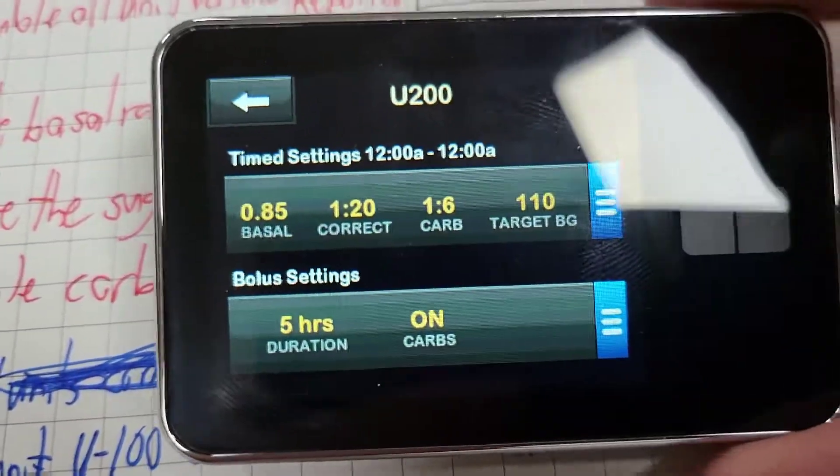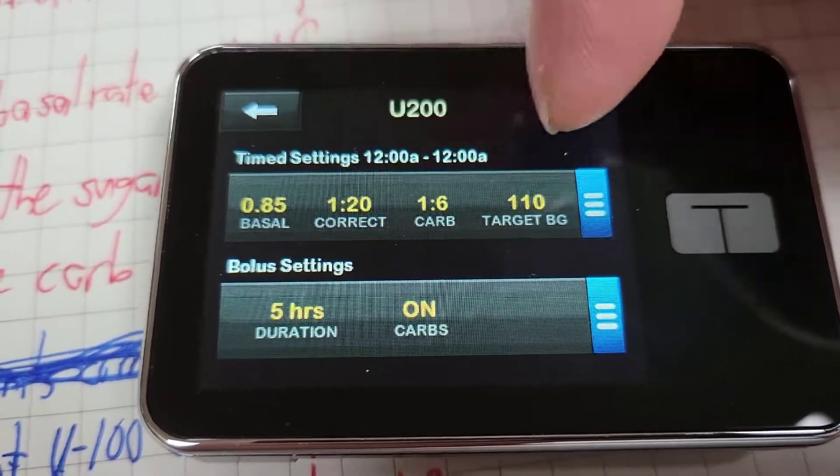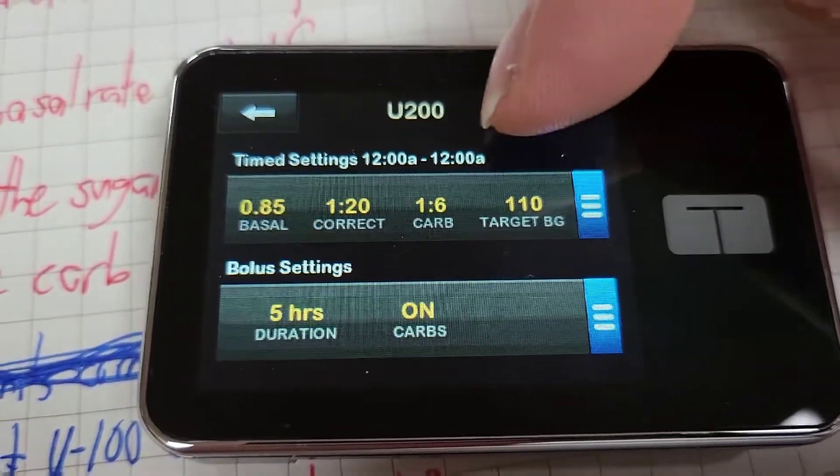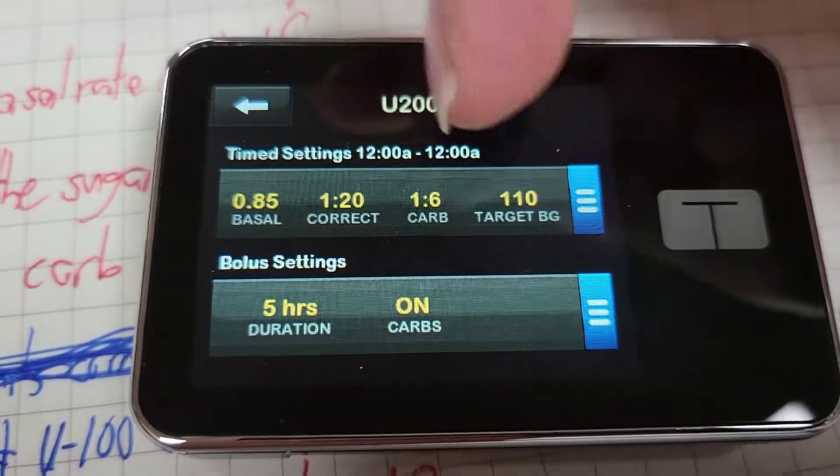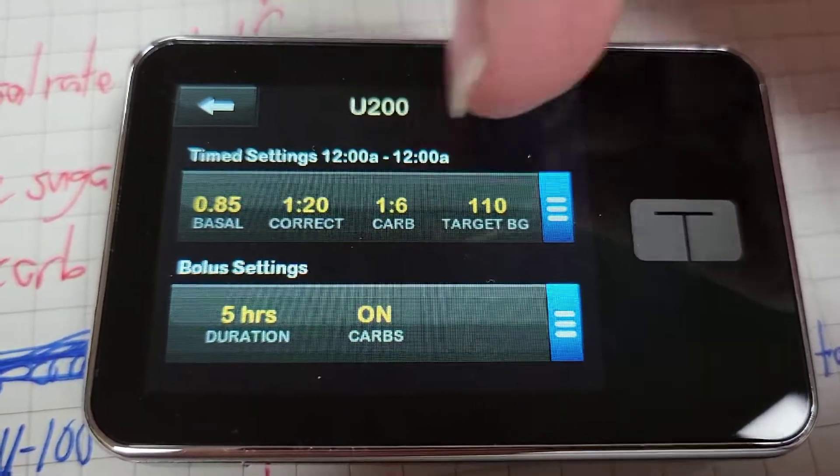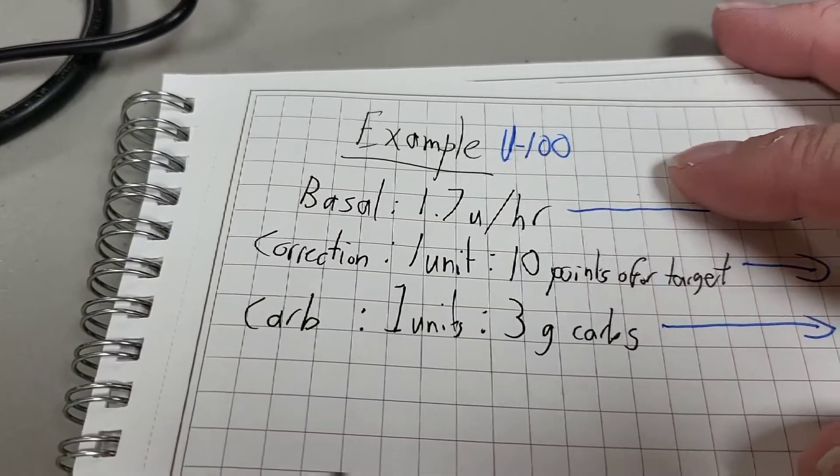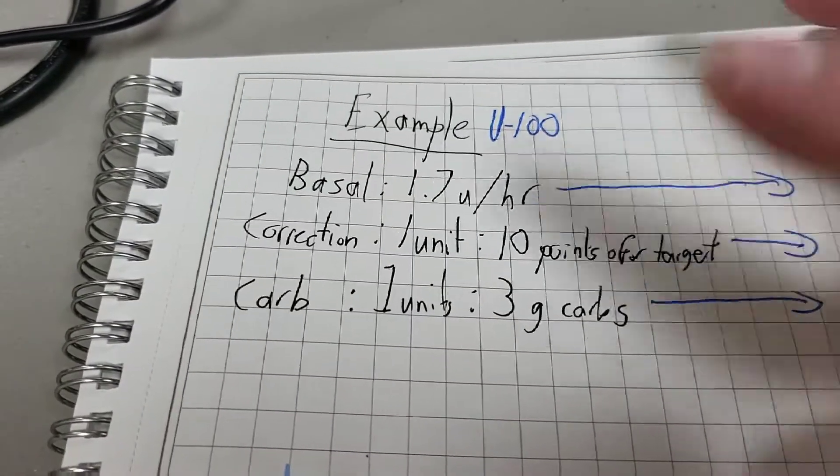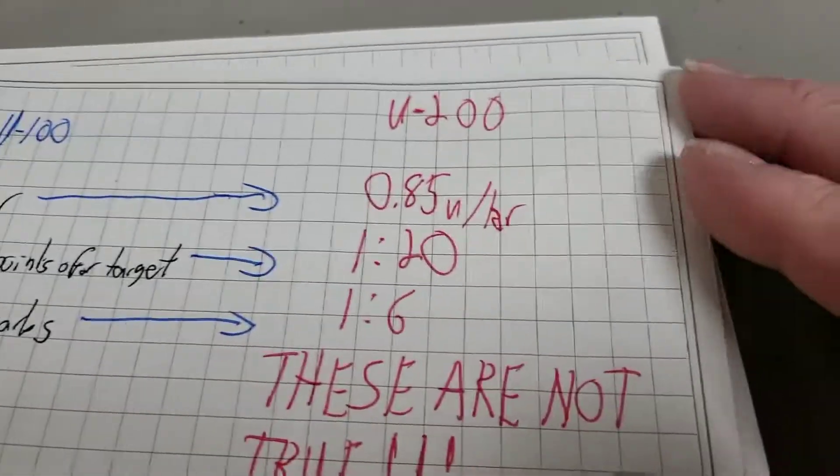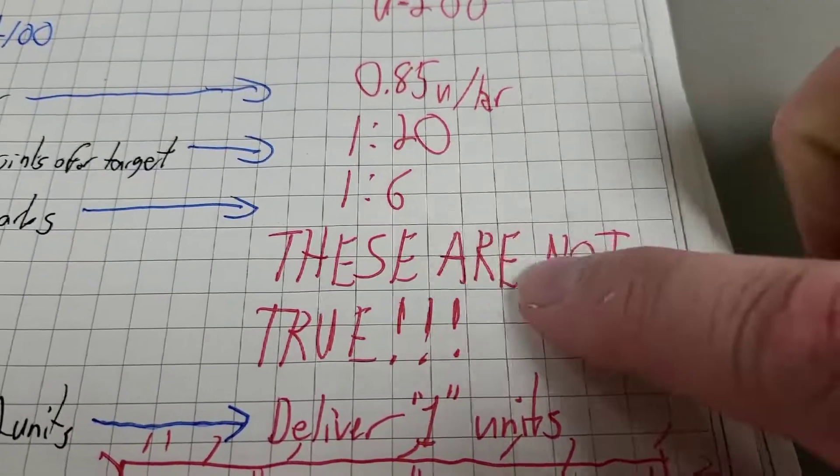Here you can see my U200 settings. All of these numbers are not actually my values. Well, except the target value is accurate. 0.85 is half. 1 to 20, that should be 1 to 10. My actual basal rate is, at least right now, it's at 1.7 units per hour. Correction is 1 to 10. Carb is 1 to 3. Using U200, it's 0.85, 1 to 20, and 1 to 6, but these are not true.